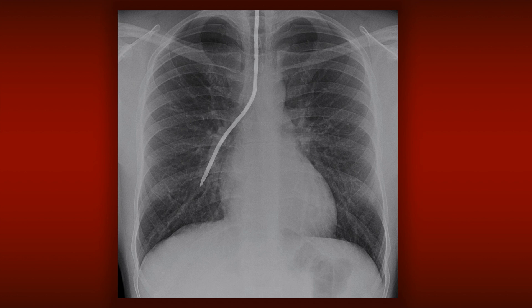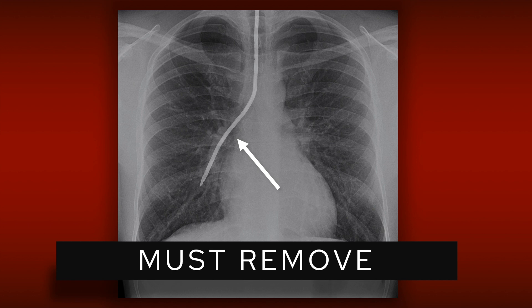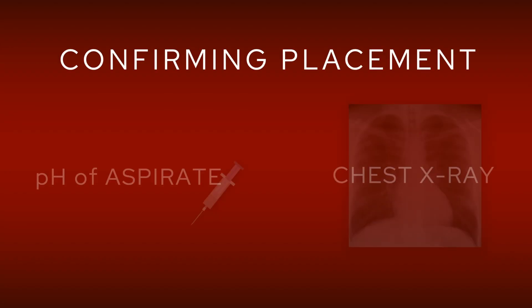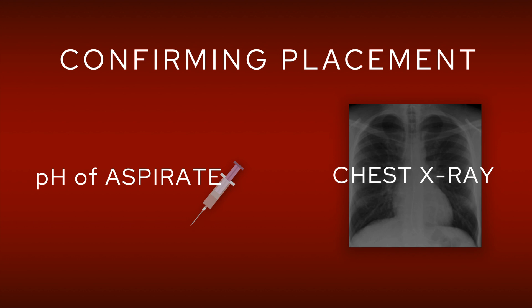NG tube placement is really important because when it goes wrong it really does go wrong, and what you don't want is the patient to be fed through their lung. Have a look at this example here — the tube is going straight down but then it goes off to the right, down the right main bronchus. This is what you don't want. If you do see this, you must make sure that the tube is removed straight away, because if the patient is fed through there it can be absolutely catastrophic and can end up in death.